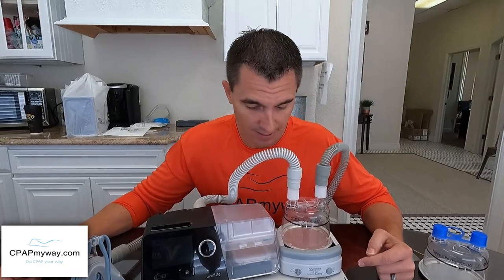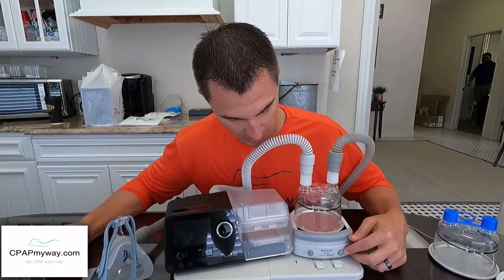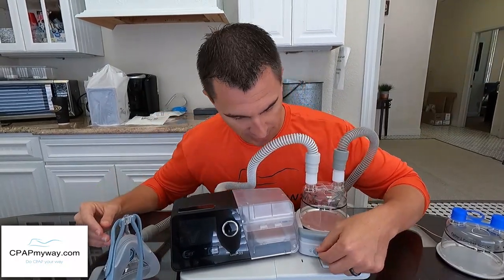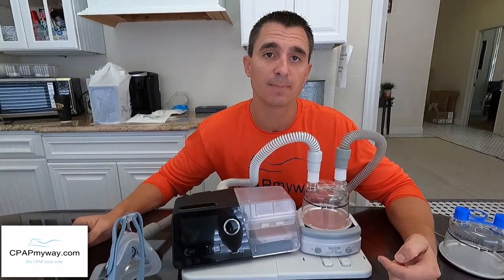Caution: if the humidifier is on, don't put your hand on the tray — it can get very hot. In the morning turn it off and the green light will go out. I recommend turning it on at night just as you turn your CPAP on, and turning it off as soon as you turn your CPAP off. Start at 2.5 — if you're still a little dry, turn it up to 3 the next night, then to 4 if you still need more humidity.